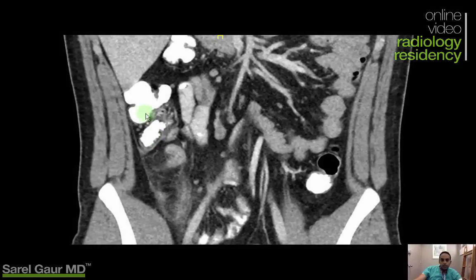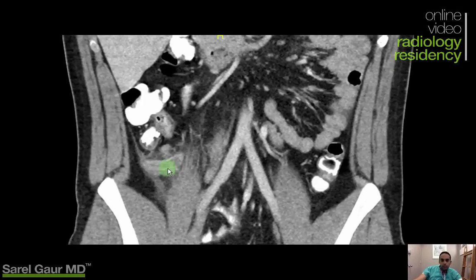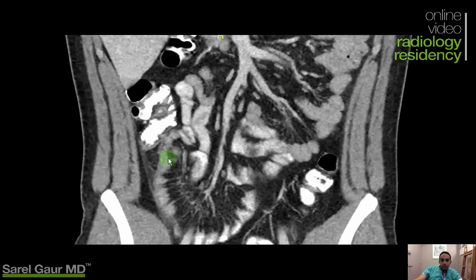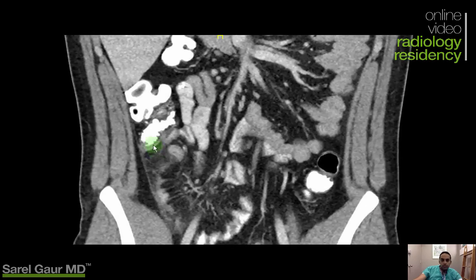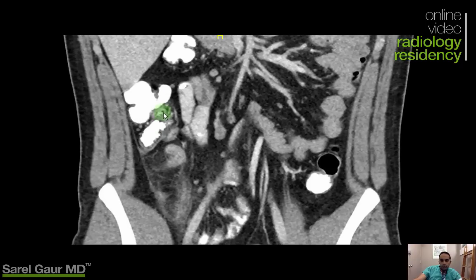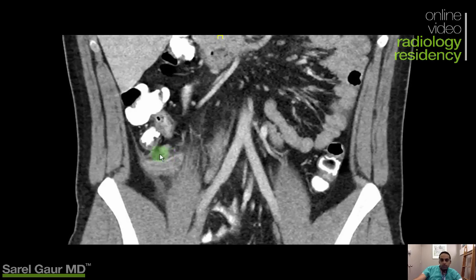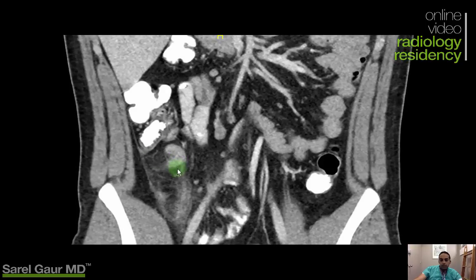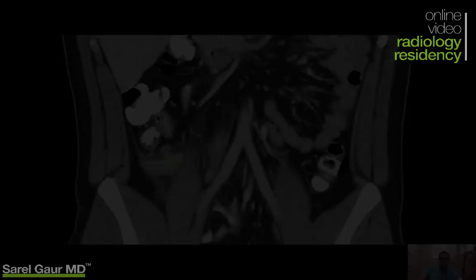To summarize the findings: fluid-filled, not contrast-opacified, hyper-enhancement along the periphery, fat stranding around it, extending from the cecum. I also want to show the fibro-fatty lips of the ileocecal valve — you can see fat here and this structure invaginating, which is the ileocecal valve. This is definitively the appendix; it's not filling with contrast. This is definitive appendicitis, no questions asked.